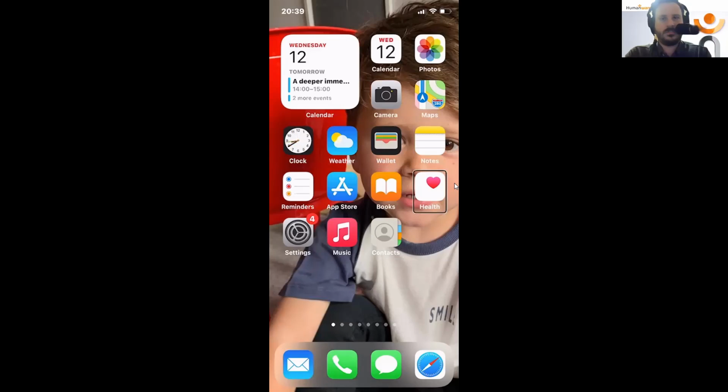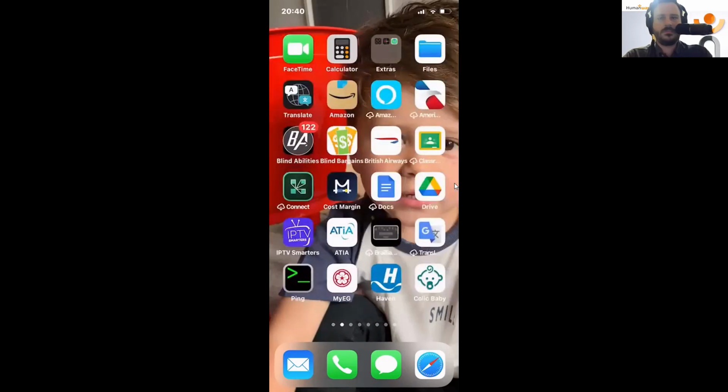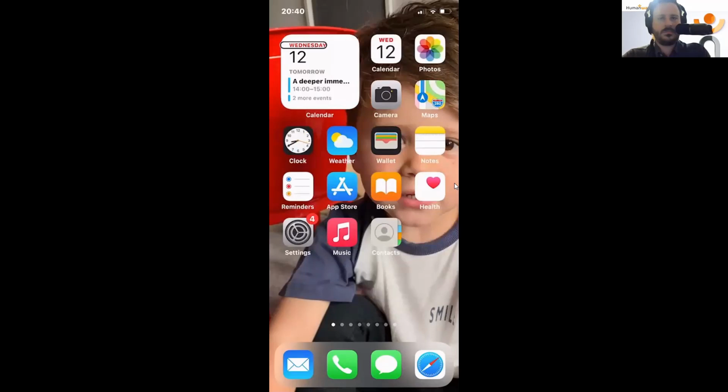Now, if I want to turn over the page, so perhaps the application that I want to choose is not on my home screen. Perhaps it's on my second or third page. To turn over the page here, we can introduce a command, space with the letter O for over. Think of turning over the page. So space with the letter O will turn over my page. And the opposite of the letter O is, of course, our OW sign. So space with dots 2, 4, and 6 will take me back a page to my previous page. Page 1 of 8.